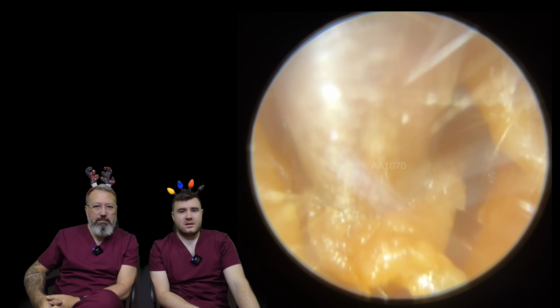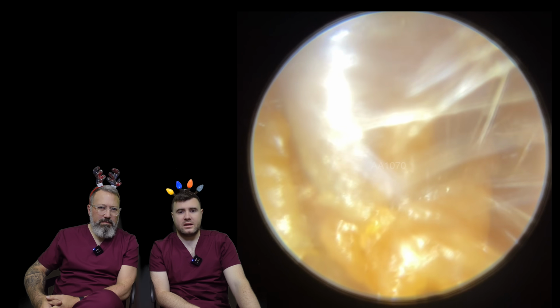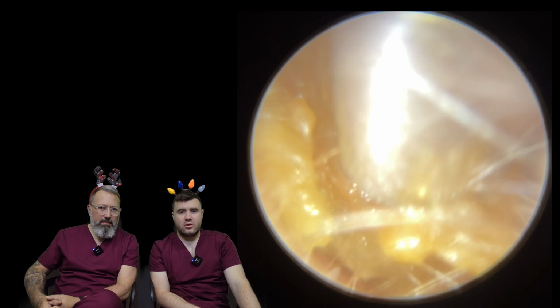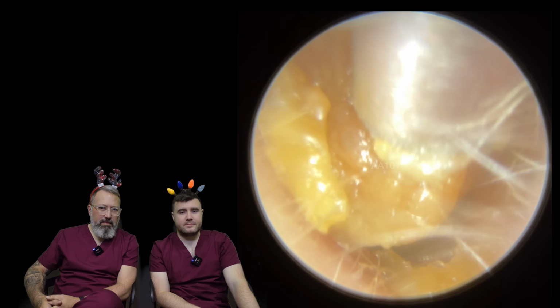So we've got standard size on the tube. You can see this one is looking pretty full. It's quite a deep set wax as well. We're just going to try and get a good grip here. Give it a little bit of a wiggle, which I'm hoping is going to take the whole thing away.